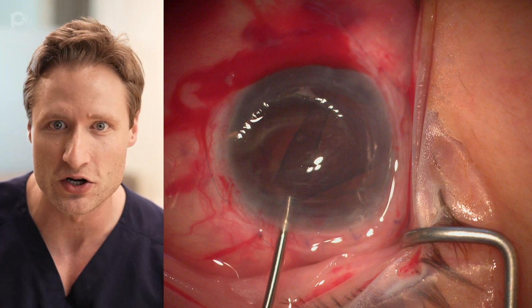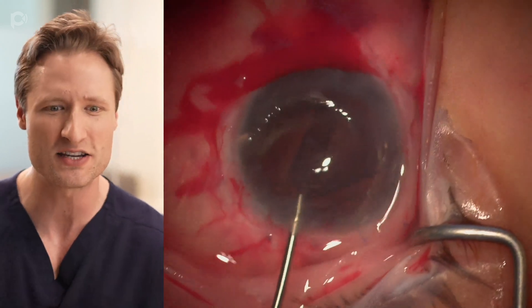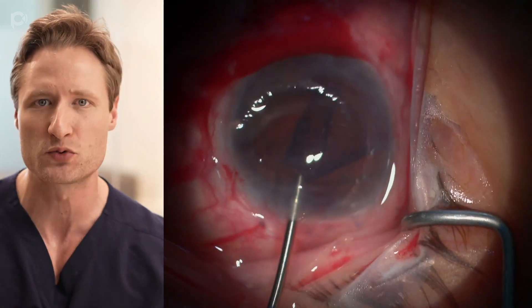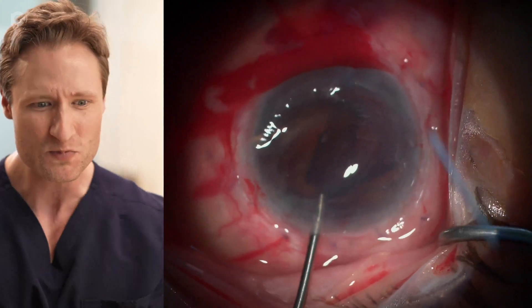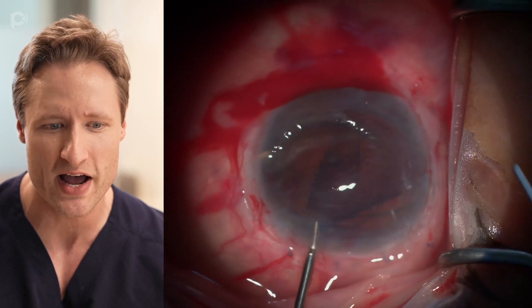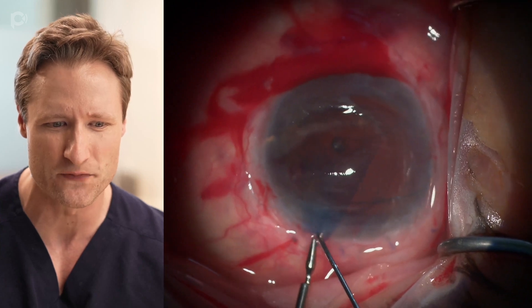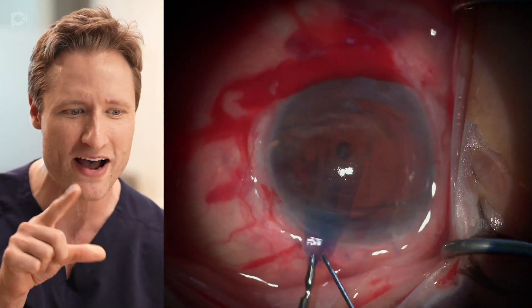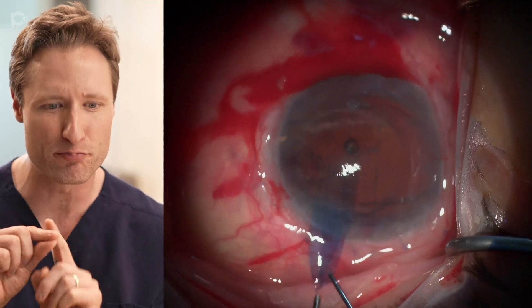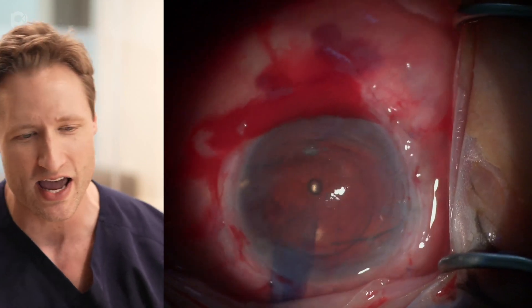Now I've got the graft held — it's not going to fall. I want to check orientation: is it right side up or upside down? I'm changing my illumination pattern with the microscope, switching to coaxial illumination, so I can use my cannula through a paracentesis 90 degrees away to try to check the Motsugo sign. But before I do that, I'm trying to disengage the forceps, and the jaws won't open — they're pinched onto the graft. So I'm having to drag the graft out of the eye and push it off the edge of the forcep to disengage it. Now the graft is hanging halfway out of the eye, the eye is soft. Things are moving from bad to worse.